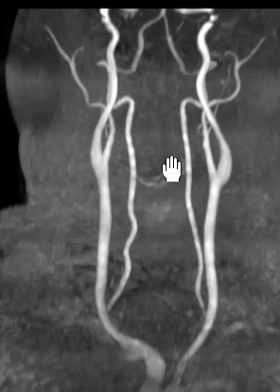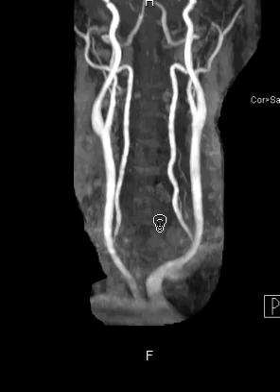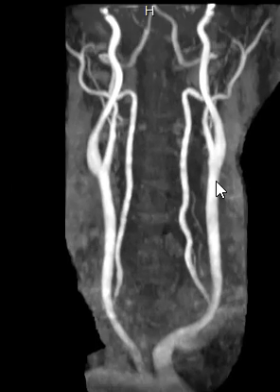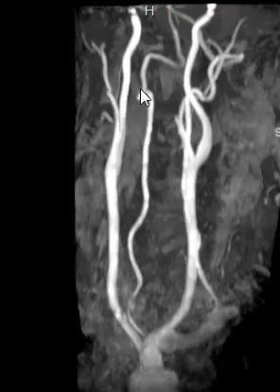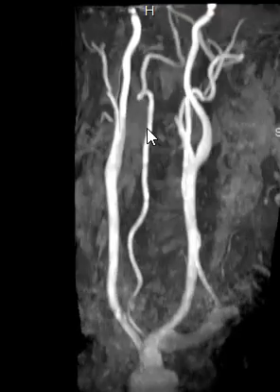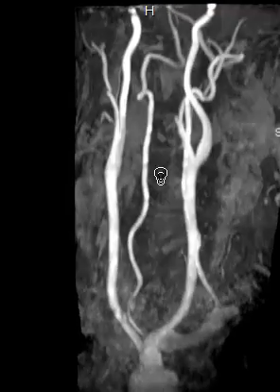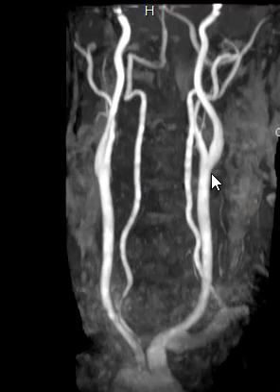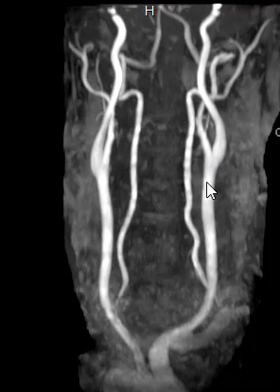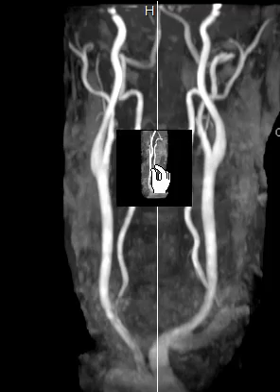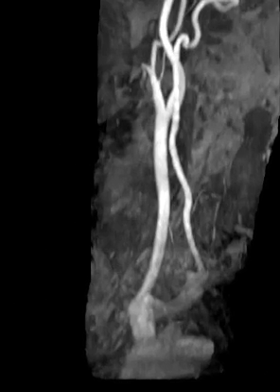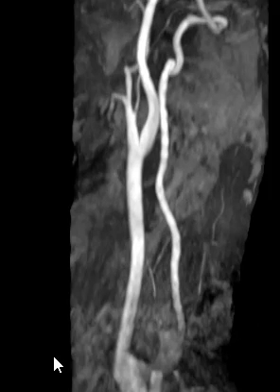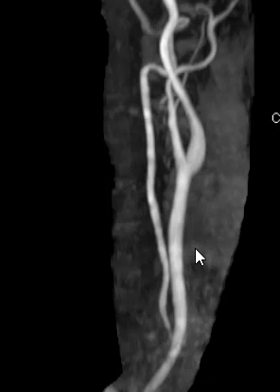We can also take this data and spin it around. On this sequence we can rotate it right and left. If there were a little area of narrowing, we can look at it from different angles to see how severe it is. We can see this branching pattern of the common into the internal and external carotid arteries. We can also cut things off to see just one side at a time, and go to the other side to look at that as well.